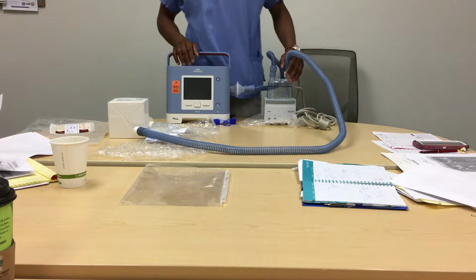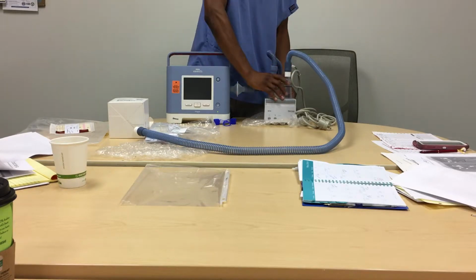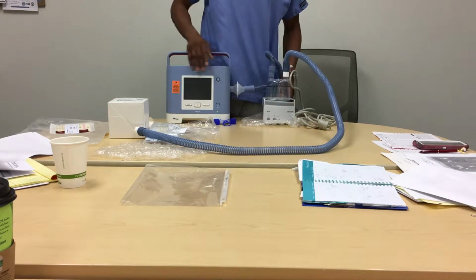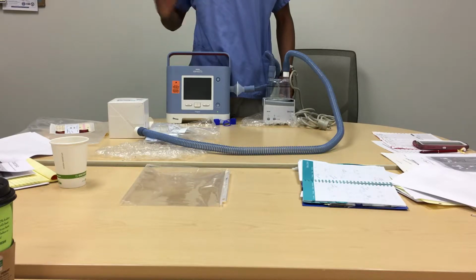So in between, can they clean that water chamber? Correct. Does it come apart? No. So you just swish it out and rinse it. What are they swishing it out with? Almost the same as the CPAP chambers. You use soft soaps: Dawn, Joy, Ajax. Some people use distilled white vinegar and water. As soon as the insurance pays for another one, change it up.